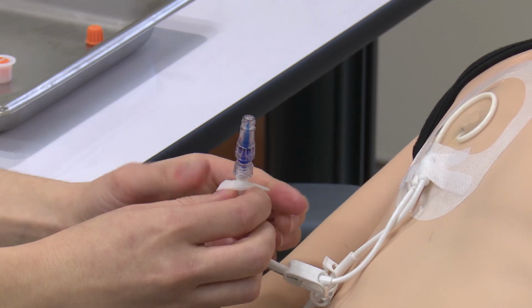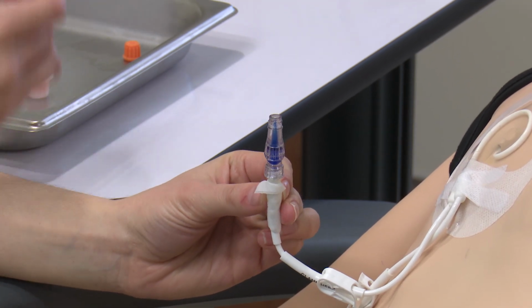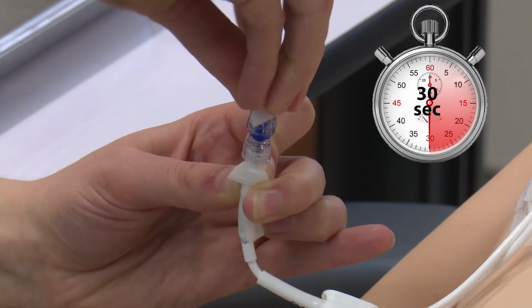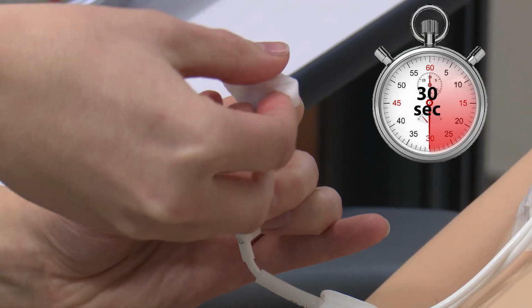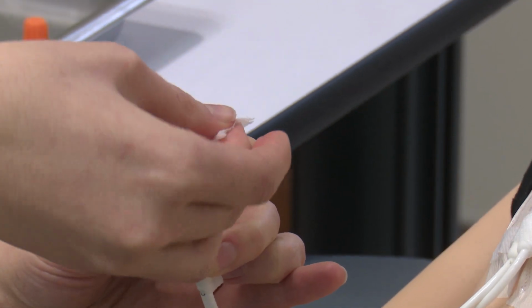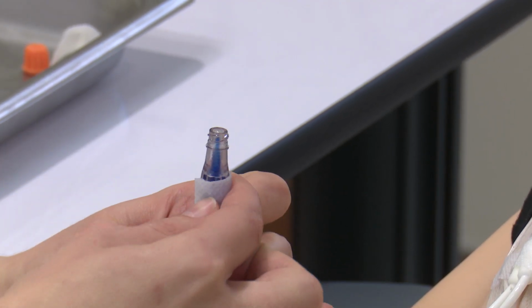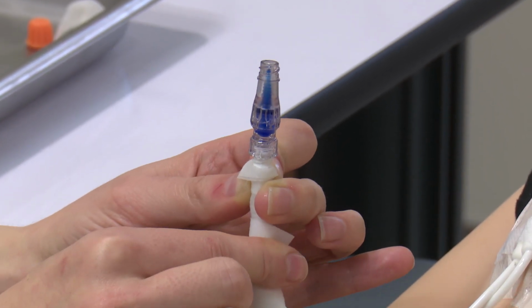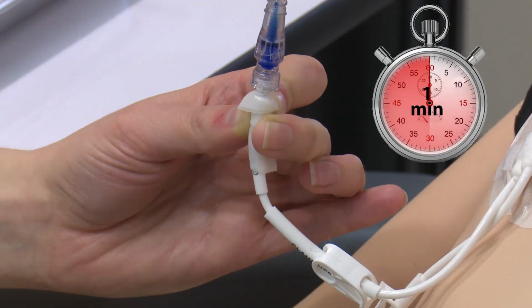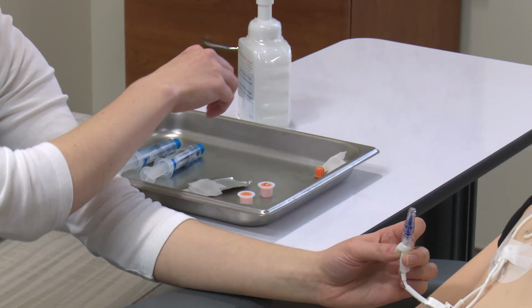Using your non-dominant hand, take an alcohol swab and use it to pick up the lumen. Pick up a second alcohol swab and use it to scrub the end of the cap for 30 seconds. Remember to apply pressure to create friction. Take the last alcohol swab and clean up the lumen towards the clamp. Allow the lumen and cap to dry for 60 seconds. Make sure you do not touch the lumen or let the lumen drop, otherwise you will have to clean it again.